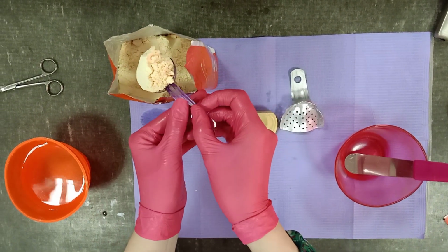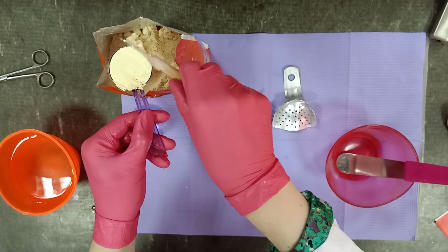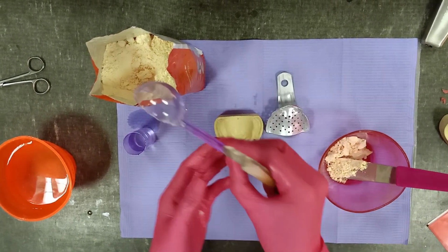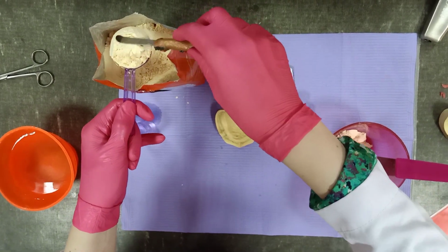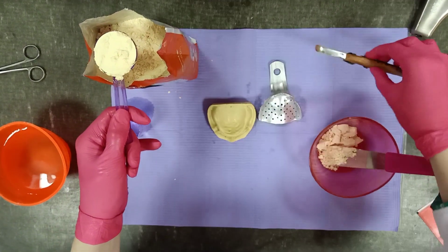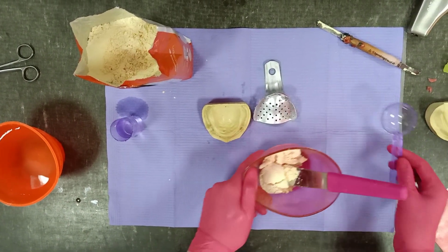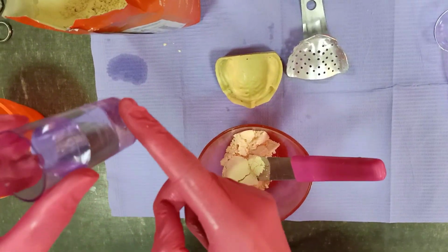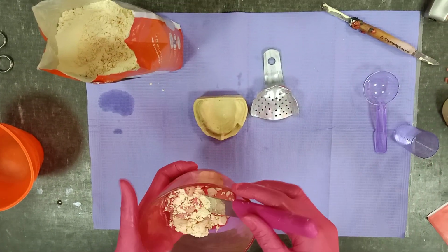For this cast, we are going to use the ratio of 1:1, 1 powder scoop to 1 part water. Here we used 2 scoops of alginate and 2 parts of water. As you can see, take the first scoop, don't press it, just use a knife and remove the excess from the scoop, add it in your mixing bowl and add the 2 parts of water as graduated in the measuring cup and start your mixing.